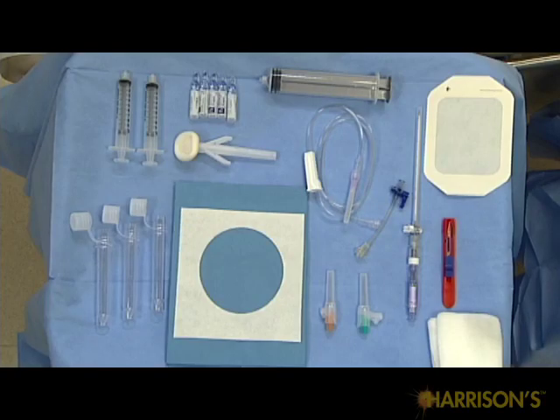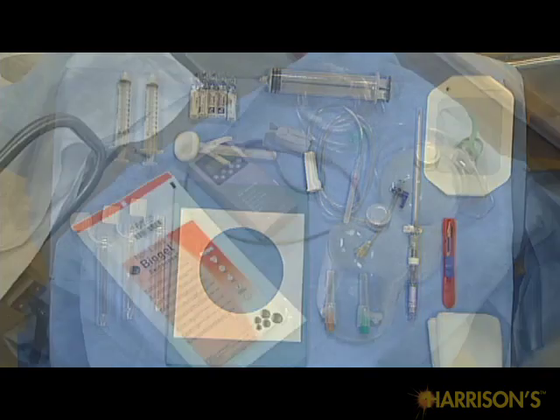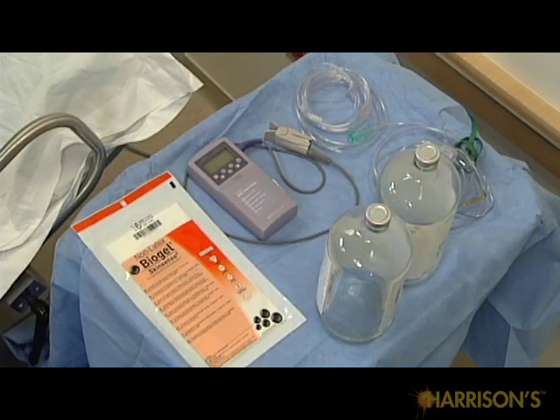It is important to have all the necessary equipment at hand before attempting a thoracentesis.